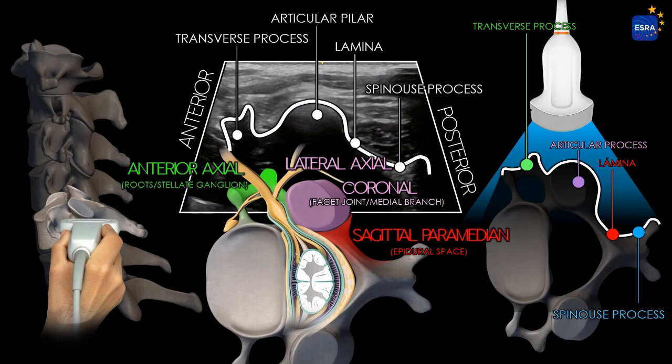The transverse process is seen anteriorly as a hyperechoic bright structure with posterior acoustic shadowing. It may show one or two prominences corresponding to the anterior and posterior tubercles, depending on the cervical level. The articular pillar, zygapophysial joint, can be identified as a rounded hypoechoic structure with posterior shadowing in the central part of the image. Laminae appear as hyperechoic lines extending from the articular pillar toward the transverse process, forming the roof of the vertebral canal. The spinous processes are the posterior continuation of each lamina, ending in two bony prominences corresponding to the posterior tubercles.